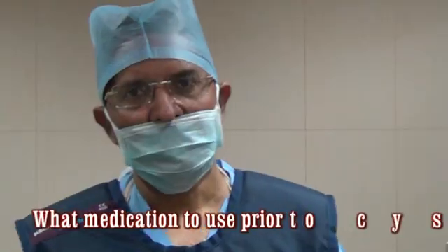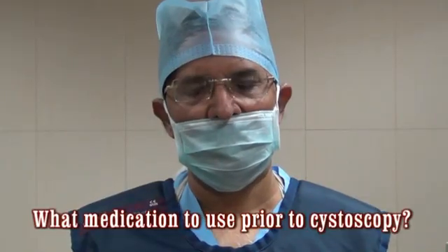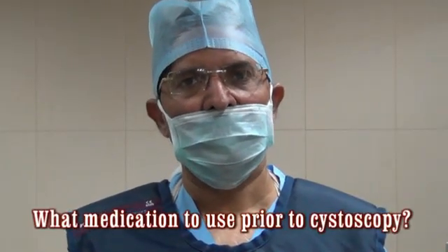Prior to cystoscopy, you will be required to give pre-medication to your patient. In pre-medication, about 10-15 minutes before the procedure, I suggest that you give the patient injection diclofenac. If there is a problem with diclofenac, like a known hypersensitivity, or a patient of uncontrolled diabetes or renal failure, or extremes of age, for such reasons when you don't want to give diclofenac, that's a different matter. But otherwise, you can give injection diclofenac about 15 minutes before. It's a very good analgesia.